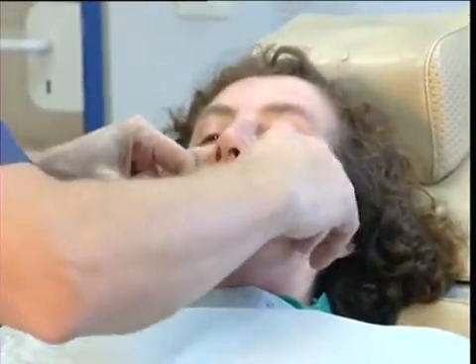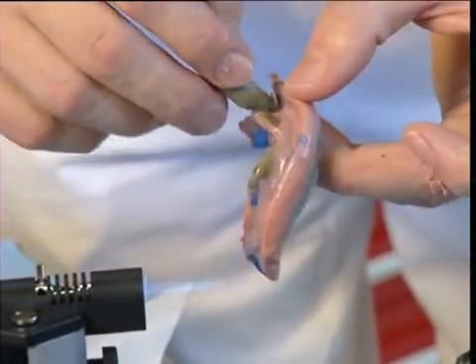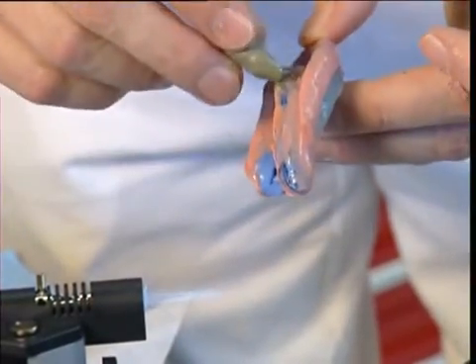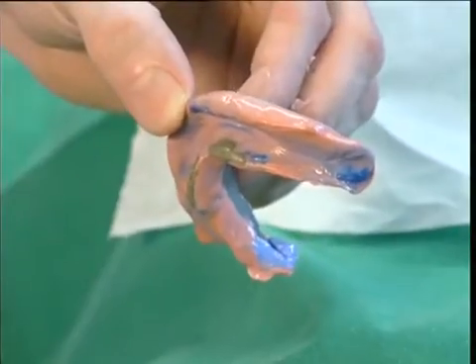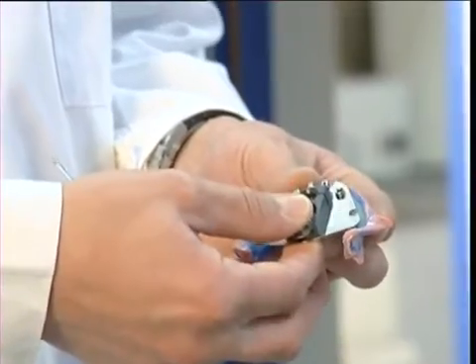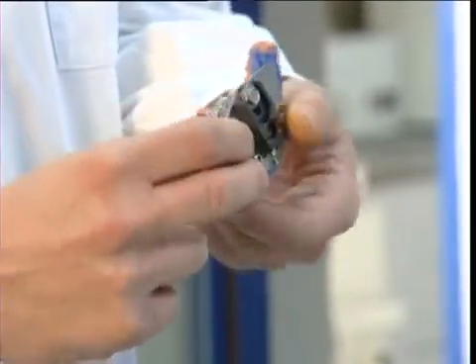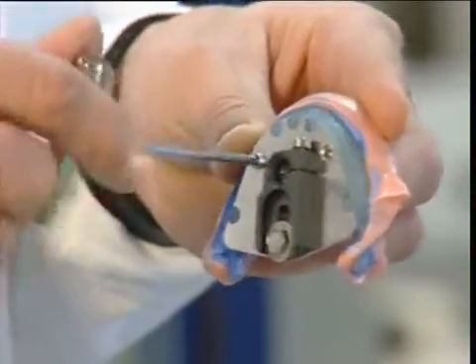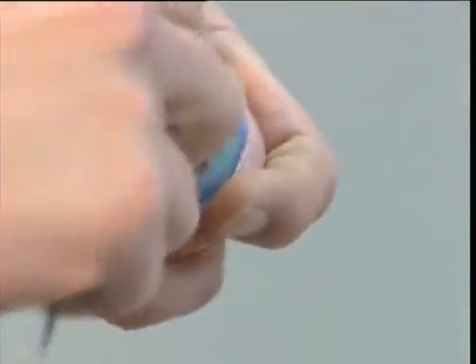Again, the floor of the mouth is massaged vigorously from the outside. Here too, the excess impression material is reduced and a wash impression taken of the sublingual space using composition. All excess material has been cleaned off the tray to ensure that the centrofixed tracing plate fits the guide groove precisely. The two grub screws are tightened carefully to prevent the plastic thread being stripped. The alignment clamp is removed and the tray placed on the mandible.